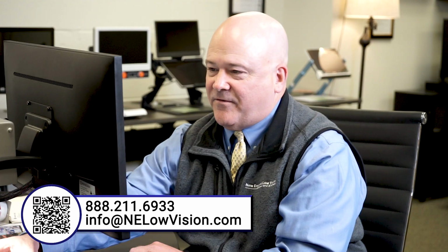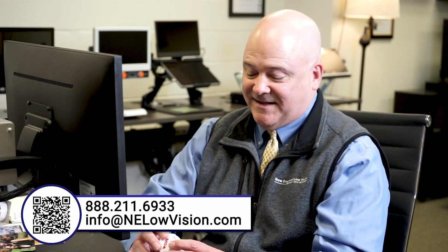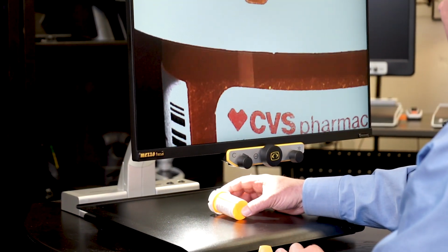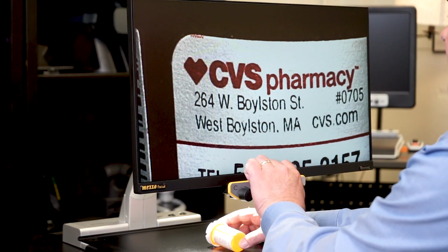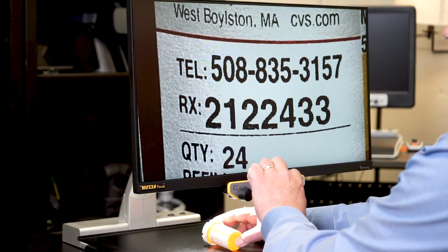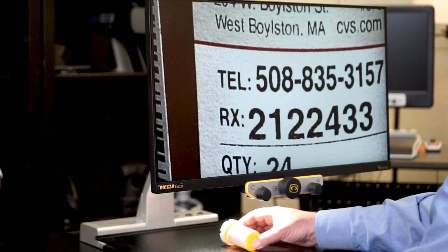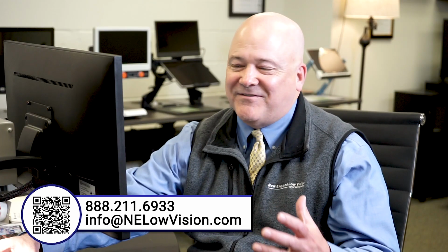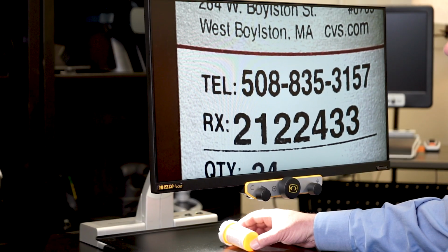I'm going to take it off here for a moment. To read it down here, that's almost micro print. But when I put it underneath the magnifier, I see it's from CVS. If I can't see that, I make it bigger. There you see the address in Massachusetts, the phone number. So all of this information, which is very hard to read, becomes huge, very large on the Mezzo. So it's very good for reading prescriptions.